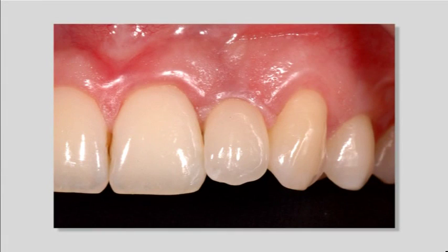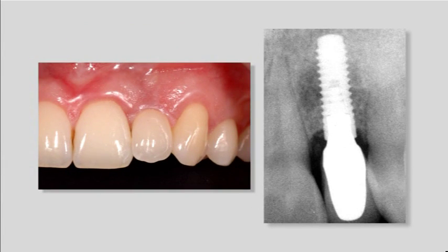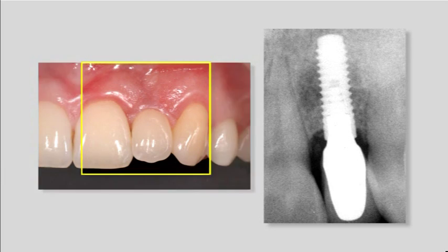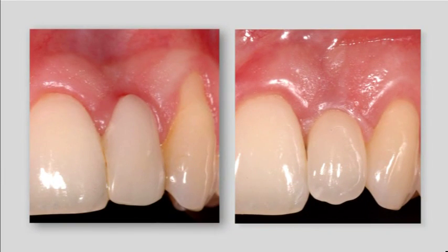The final treatment outcome, 6 months following implant surgery, is pleasing. The root coverage of the canine is successful. The periapical radiograph shows stable crest levels around the implant and minimal bone remodeling. The implant has an excellent long-term prognosis if good home care is provided. This direct comparison of the pre-operative status and the final outcome clearly shows significant improvement of the dental aesthetics.